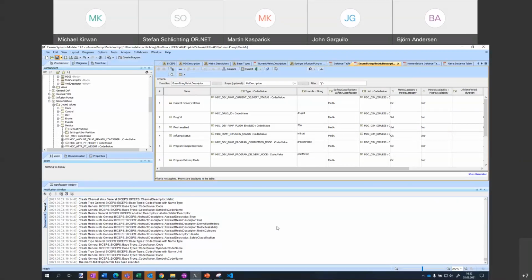So of course, for example, let's say here's safety classification. This constraint you would have already, which you can choose. This constraint you would have already also when you have a quite decent XML editor, because it just reads the schema, knows it's only these 4 fields, and that's it.